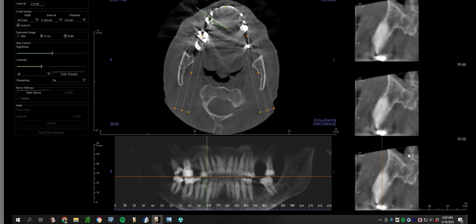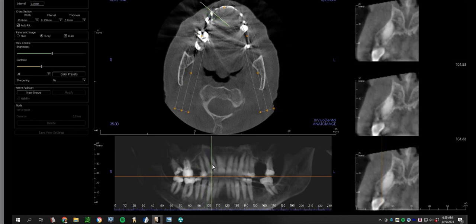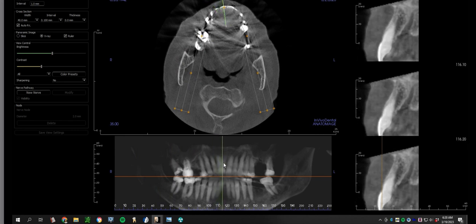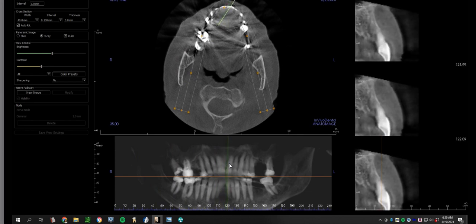But as I come across, it's very evident that the patient probably has chronic sinusitis or allergies or both, or something that's causing nasal mucosal swelling. So I think seeing our ENT colleagues would be a nice benefit to the patient's overall health and well-being. So again, I'm coming across and I'm looking at the apices of the teeth. I'm not seeing much here. There's our nasal palatine canal as we switch over to the other side.